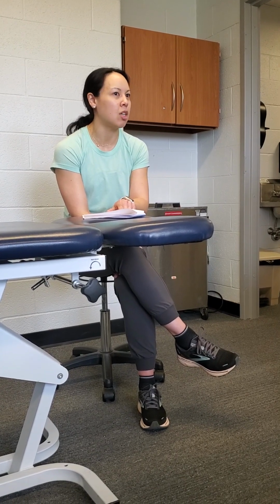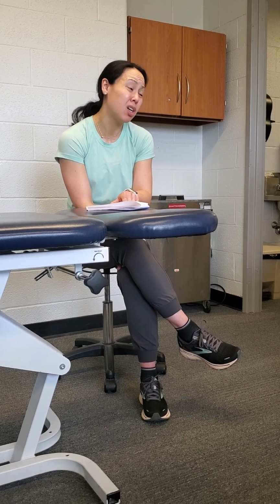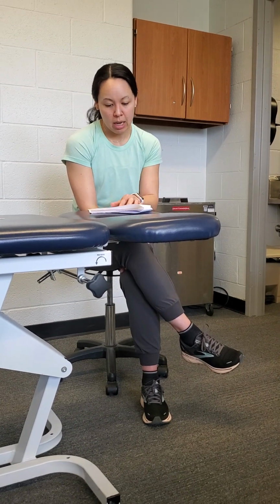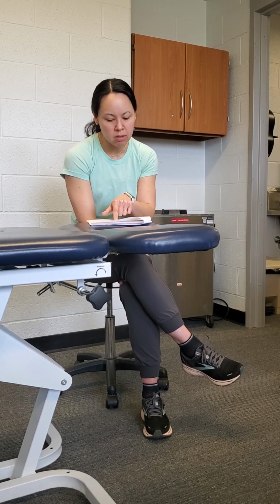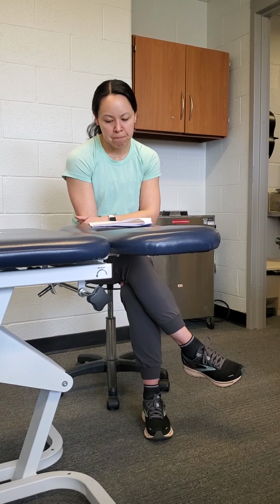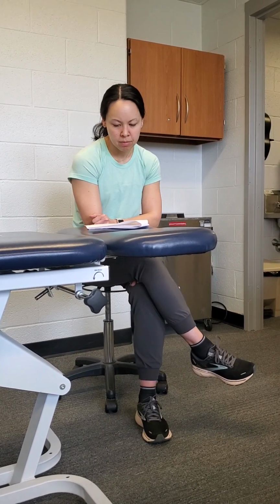Like I'm thinking of someone trying to do a stationary lunge and they can't even tolerate that. If their pain's above a 4, you might want to try some BFR and see if that helps modulate their pain a little bit, and it's been having some positive effects in some of the studies. There was an Achilles tendon study, a patellar tendon study, and even a tennis elbow study. This might be getting into the weeds a bit, but I can definitely see its use for pain management.